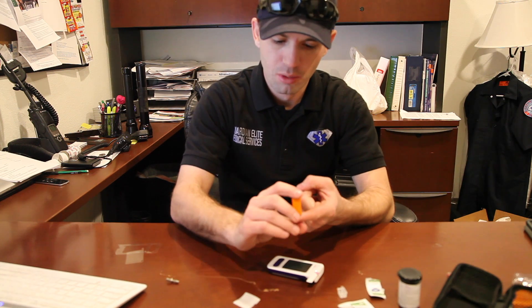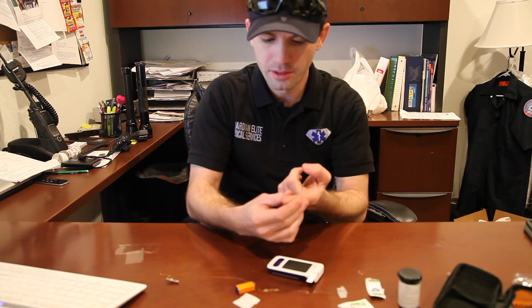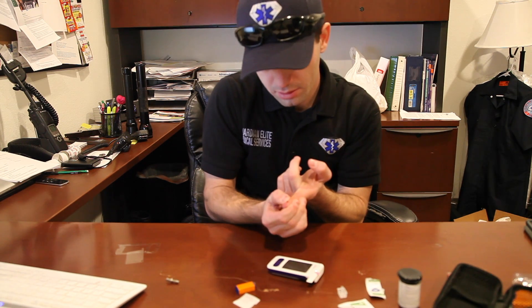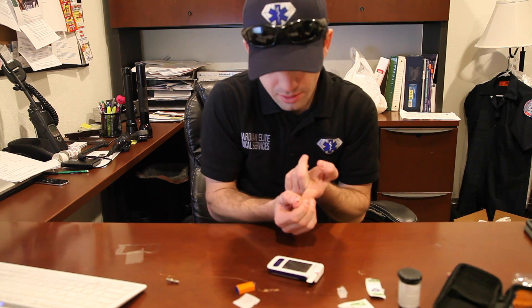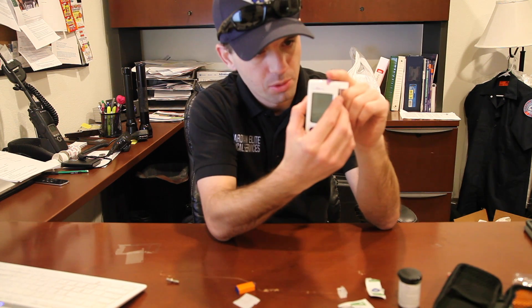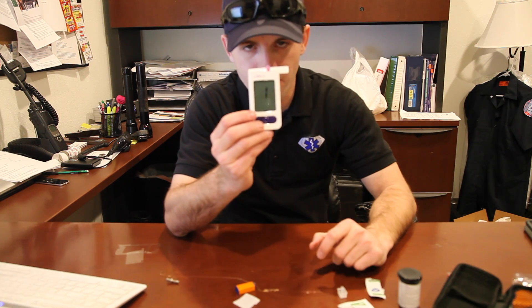Take the lancet and push down. Then you can go ahead and milk the finger until you get some blood, a nice good amount. Then place the blood into the top of the test strip. The test strip will go ahead and pick up the blood and let it accumulate. You'll hear it click. Once it starts counting down, that means it's ready to give you a number.